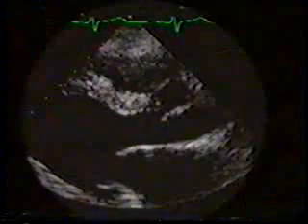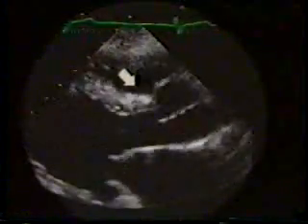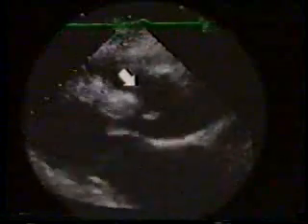This is the parasternal long axis view of another patient who is 16 years old and has a small perimembranous ventricular septal defect. The defect could not be clearly visualized on the 2D examination.